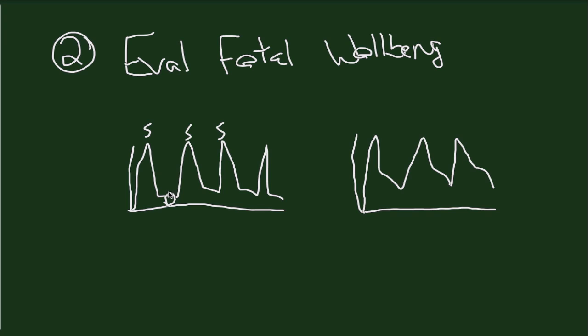There's increased resistance to blood flow in diastole in this waveform as compared to here. Again, if this is systole and this is diastole, there's much more blood flow here. This is interpreted as decreased resistance to blood flow in the middle cerebral artery, and this indicates a compromised fetus.